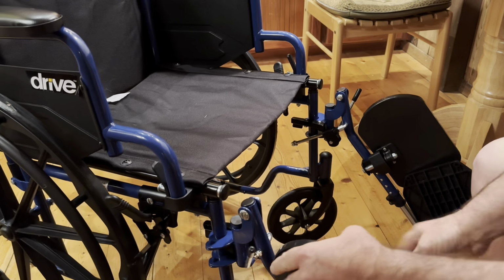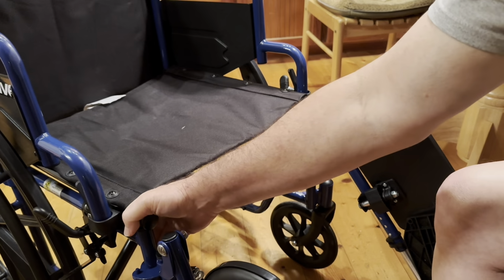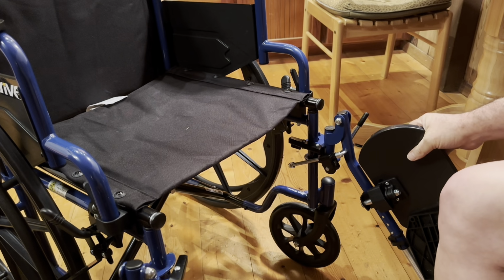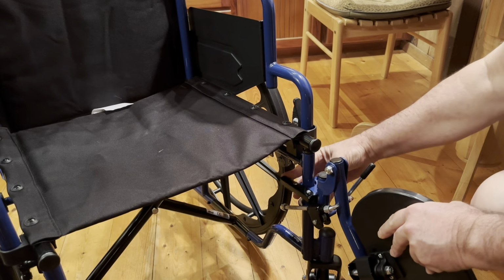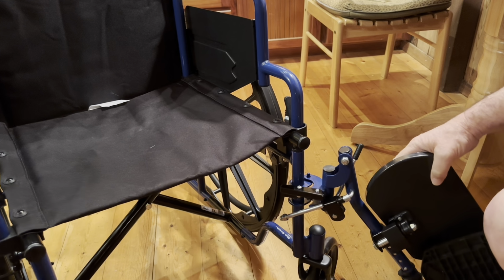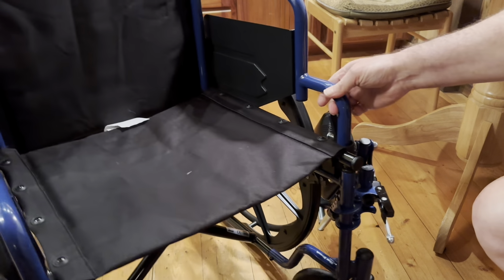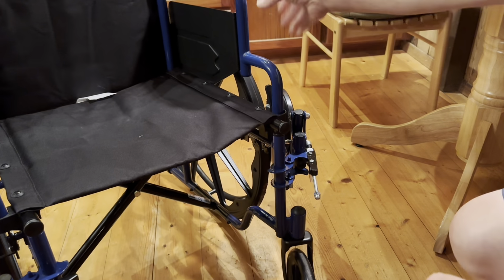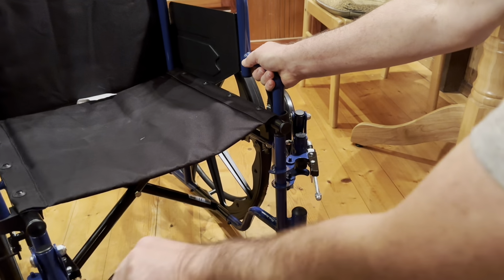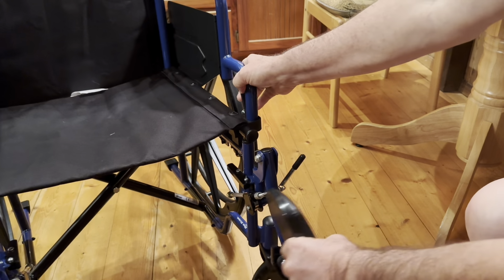Okay. So even if you're helping someone to get into the wheelchair and this stuff's in the way, you could actually put this so it swings outward. Okay, I'll show you how this side works. Same way. Have it swing outward. That way it's totally accessible if they're getting in from the bed or whatever. And if you want to lock them back in place, swing it back towards the middle and it's locked.